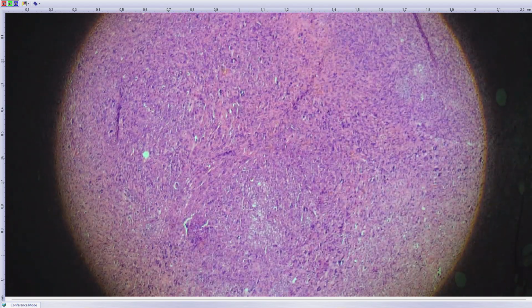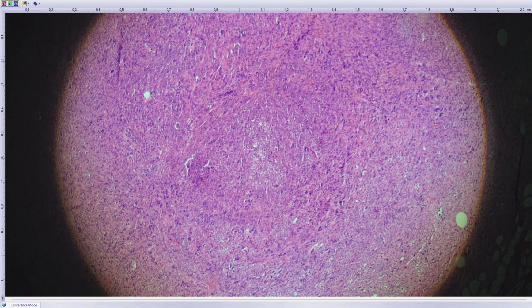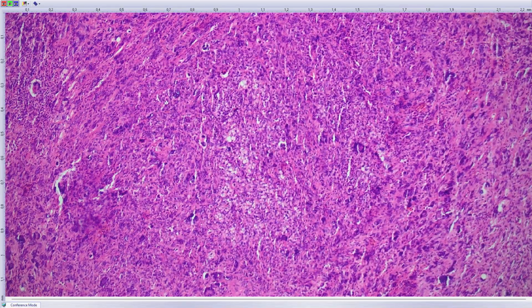What is good to know, if you have undifferentiated pleomorphic sarcoma, which is basically the same tumor without the adipocytic differentiation, these tumors are basically the same by molecular and by epigenetic or methylation analysis. These tumors are identical. Also, clinical behavior is the same. So UPS, undifferentiated pleomorphic sarcoma, is essentially the same tumor as pleomorphic liposarcoma, just pleomorphic liposarcoma shows areas with adipocytic differentiation.